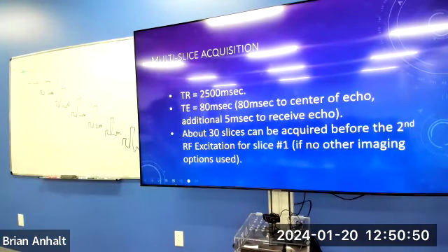Question, are you exciting it uniformly or is it varied over time? What do you mean? Like every excitation pulse, is it always uniform at the same time when you started, or is it varied, or can it be variable? Well, what do you mean by how varied, in what way? The timing? No, the timing's always the same. Otherwise, your contrast would change, right? Yeah, the timing's always gonna be the same.